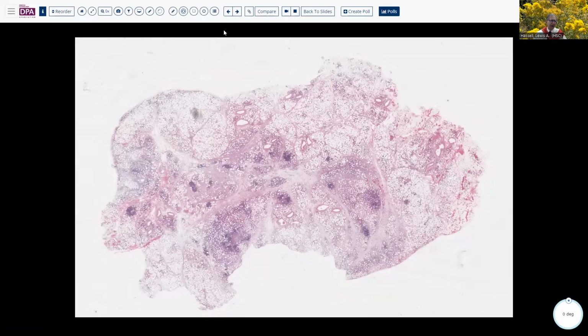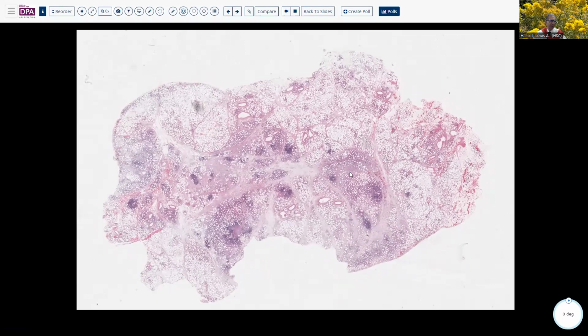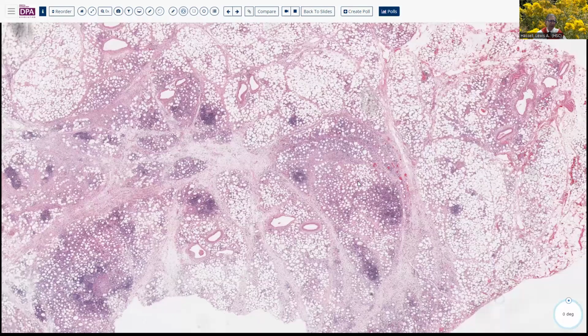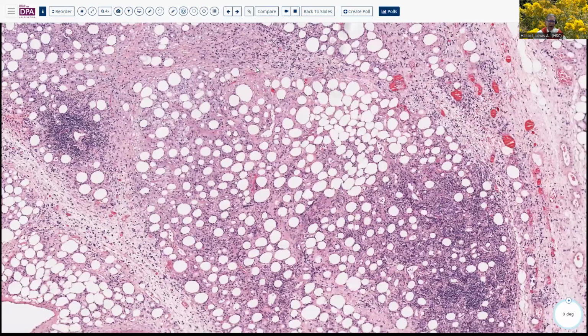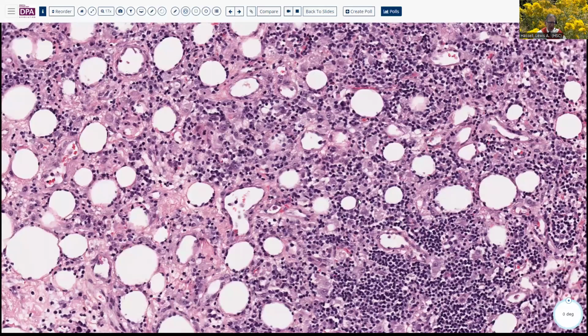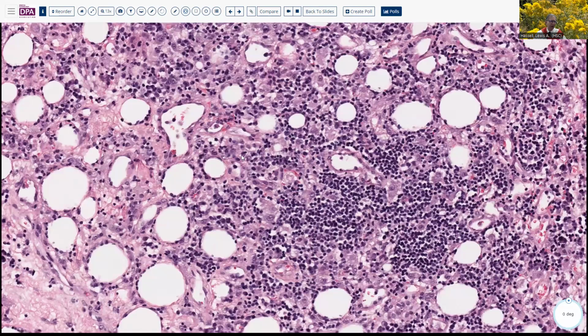So coming back to the deep tissues, intra-abdominal tissues, a lesion that can overlap with this process is represented in this slide and the next couple of slides, where you can see we have lobulated fatty tissue with a panniculitis type of appearance, quite a bit of inflammatory cells. And I think you can appreciate that there's probably some plasma cells in here along with the lymphocytes and these larger histiocytoid type cells. So it's a mixed pattern of inflammation.